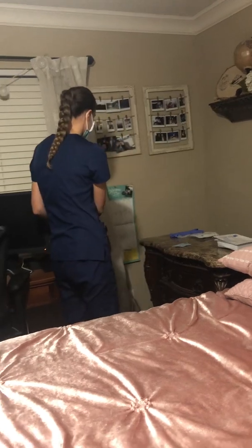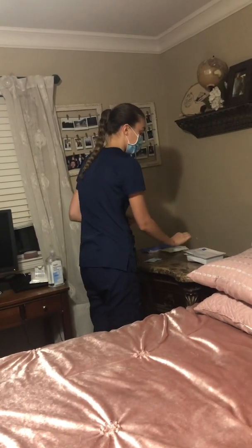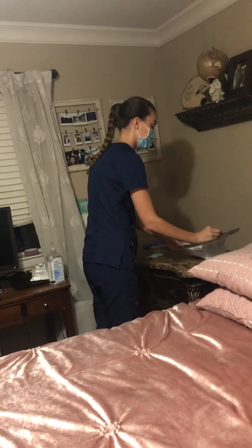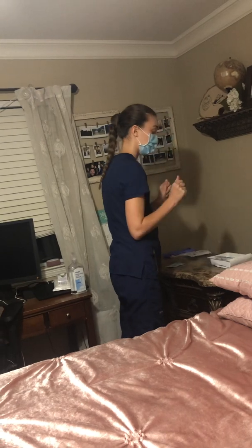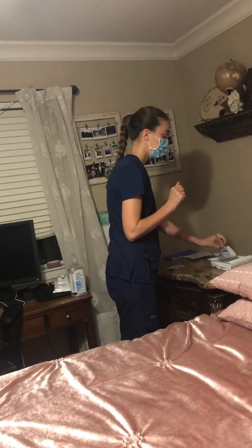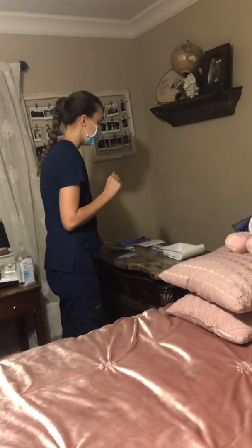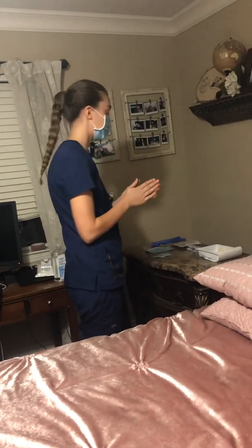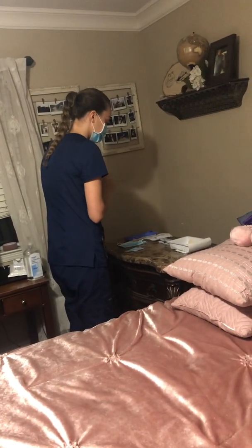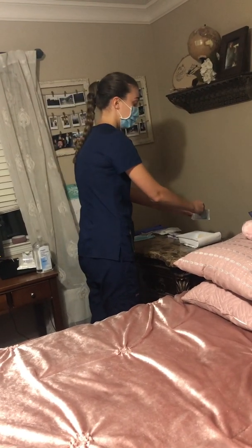Alrighty, I'm going to go ahead and wash my hands. I'm going to open up my tray. My hands are clean, so I'm going to go ahead and take out my sterile gloves and the mask. And due to COVID, Mrs. Jones is already wearing her mask as well as I am. Otherwise, I would be placing the mask on the patient at this time. Alrighty, so I'm going to go ahead and take the bio patch, open it, and drop it in.